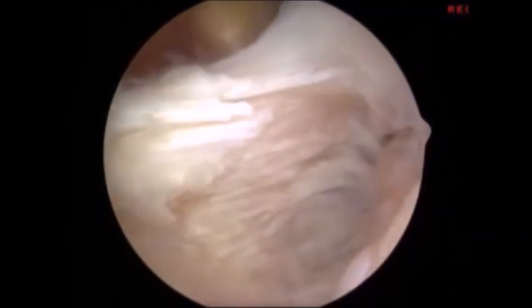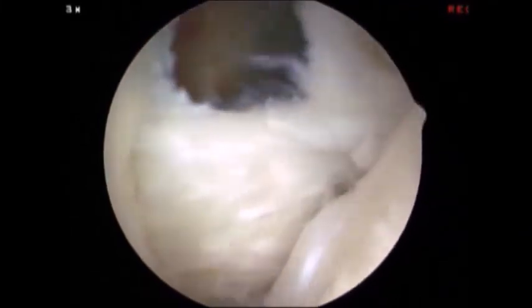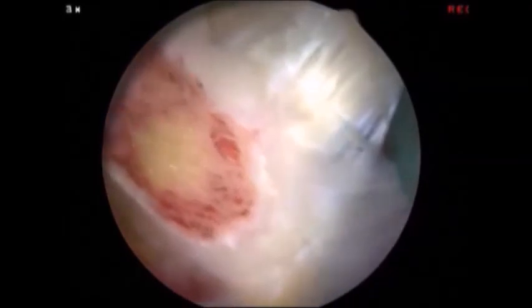In this particular example, a repair was accomplished using an anchor. We can see better reapproximation of the subscapularis tendon, see knots, and good repair.